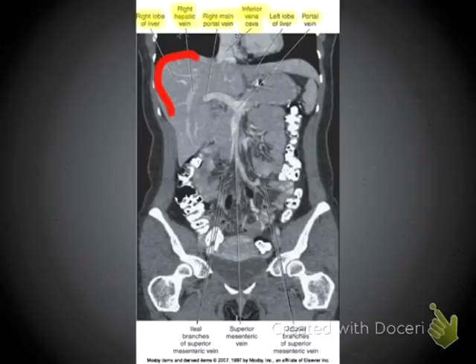Based on this image, we see that we have the liver, the spleen, and then we have the portal vein here. The right main portal vein there. And that's as far as we're actually going to get in terms of this image, because it's kind of far away. And I don't know whether we can actually discern too much of the venous system of the liver.